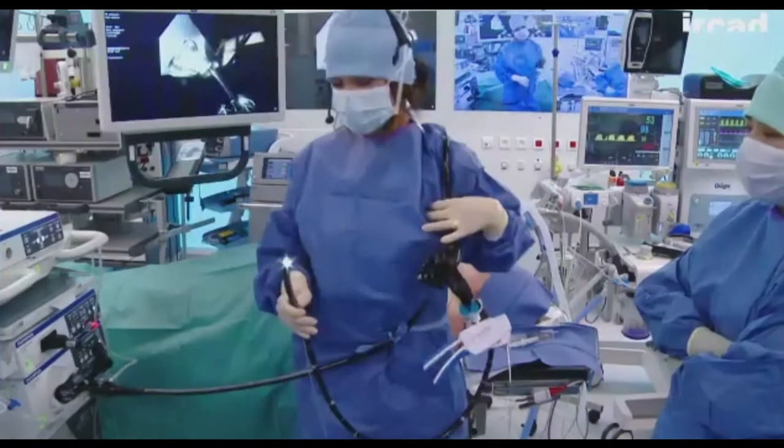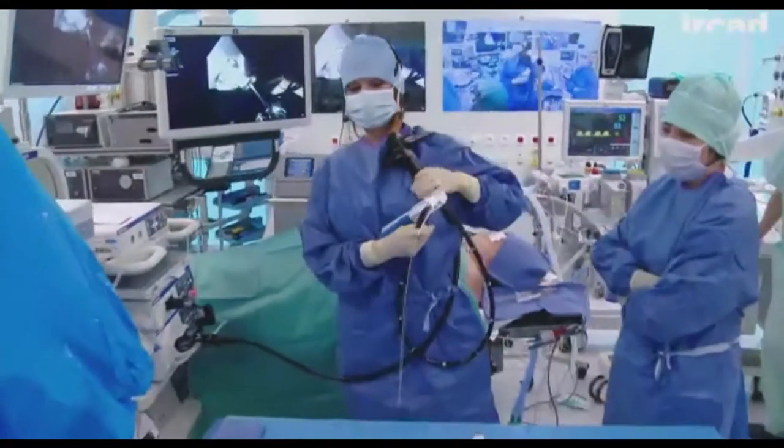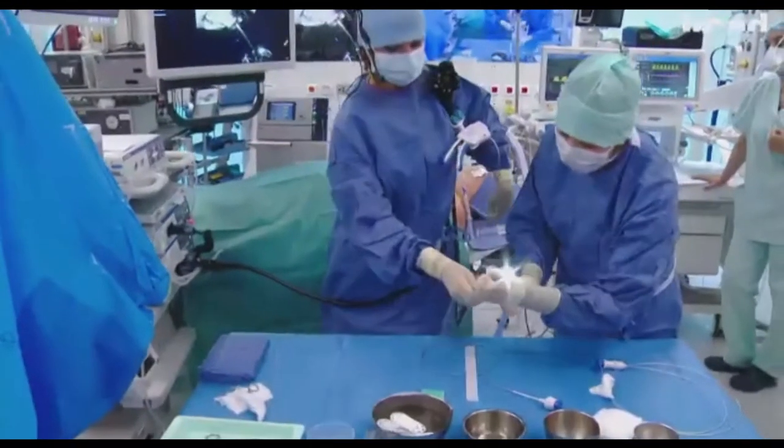So we're going to go ahead and start. I'm going to start charging my suture. I'm going to ask Rita to hold the scope for me.